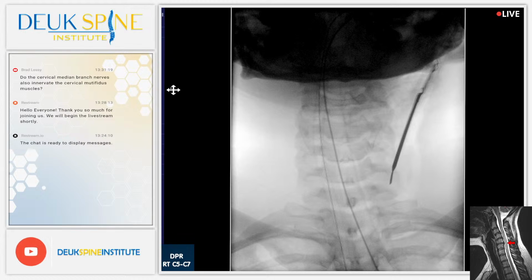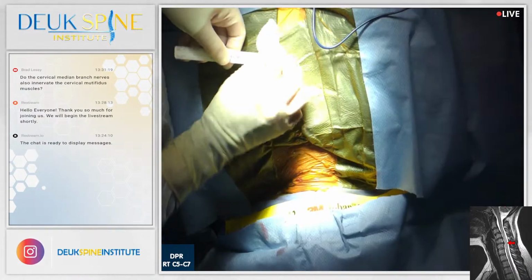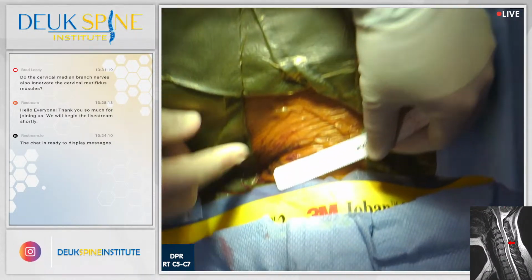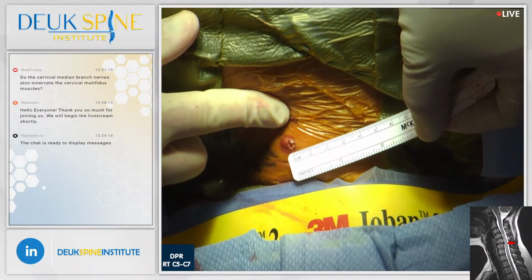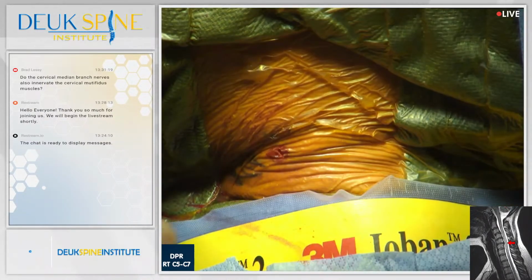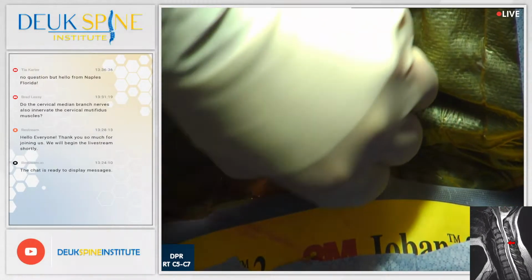I could feel the pain nerves get severed, which means cut. We've lost about 2 mils of blood, 2 cc's. Let me show you the incision. It's tiny. Look at this. Can you see this, Henry? Yes, we can. So you guys see that incision right there? It's tiny. Yes, we do. All right. And that should heal up quick, within just a day or two.